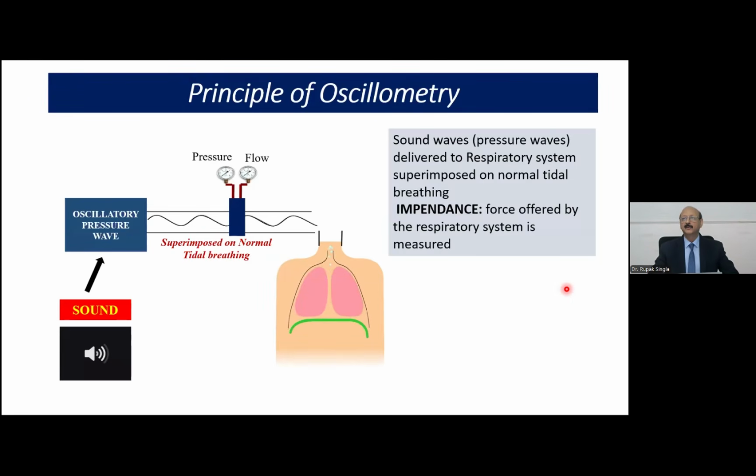If you understand the principle of oscillometry, basically the sound waves, which act as pressure waves, are delivered to the respiratory system. They are superimposed on the normal tidal breathing, and the impedance, which is the force offered by the respiratory system, is measured.